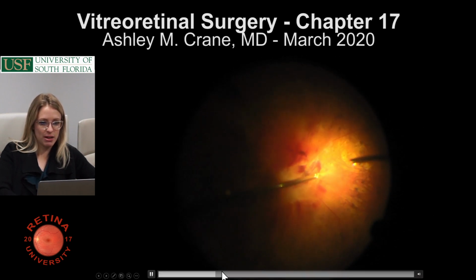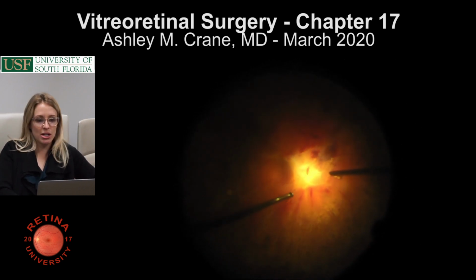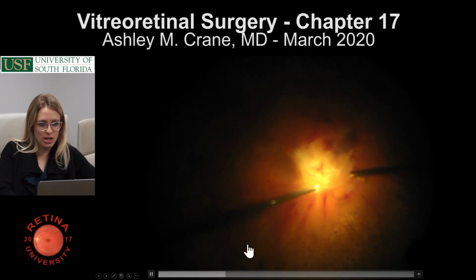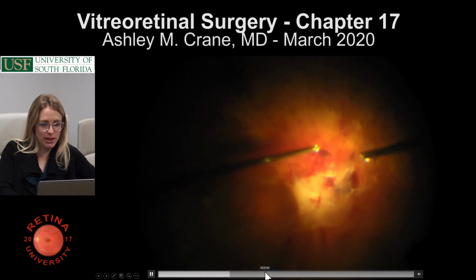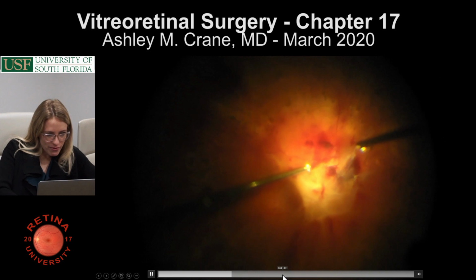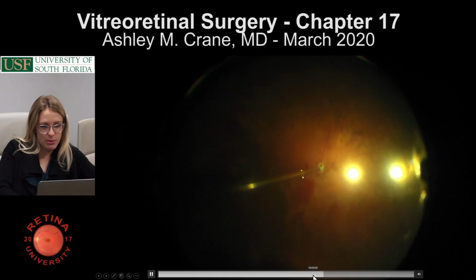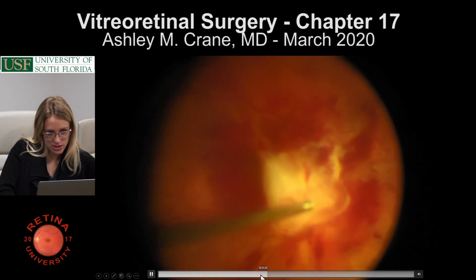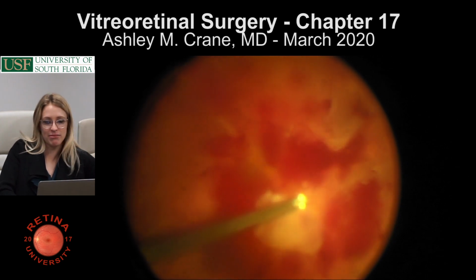Let me see if I can, maybe I'll advance it a little bit and see what kind of progress is made. But these surgeries can take a really long time. These can take 2 hours, could take more. Some people would do them much quicker, but it really depends on the surgeon and on the pathology. Let's see if we've made any progress, so we've apparently made progress by then. Well, so I believe here that we're trying to decrease the bleeding. It seems like we already got the traction off. But basically you pick at it and try to separate the two.